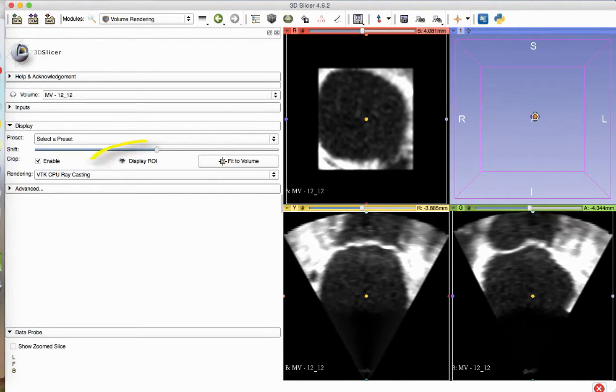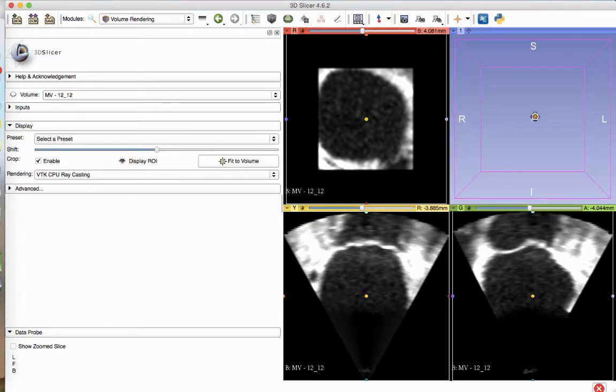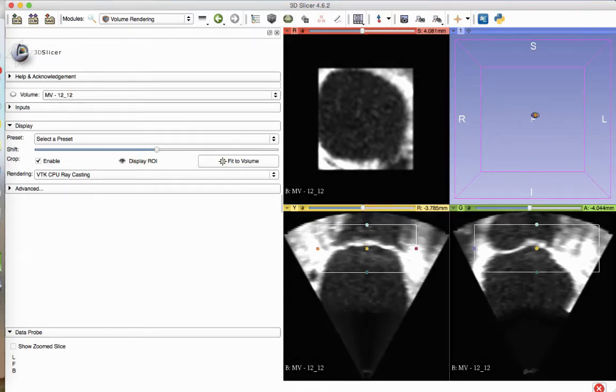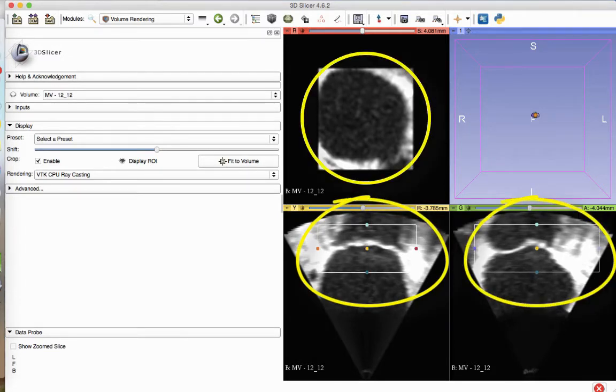Now, activate ROI visibility by clicking the button that looks like a closed eye next to the text Display ROI. The region of interest will now be displayed in the red, yellow, and green boxes. Adjust the size of the boxes to approximate the volume that you will print.